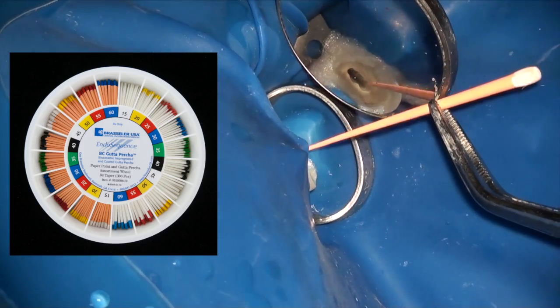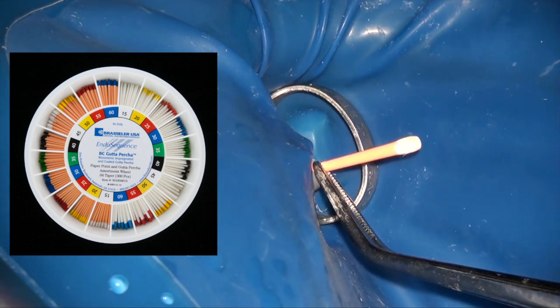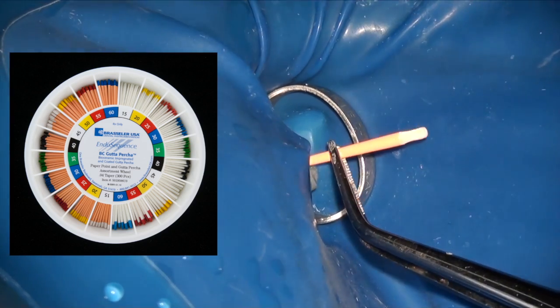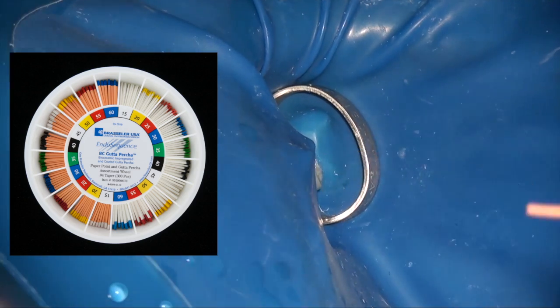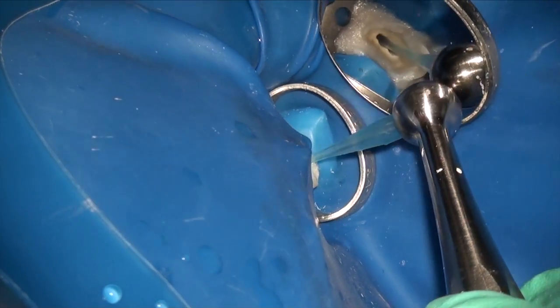Now I'm basically fitting my matching BC cones, bioceramic cones. This is the 4504 matching cone for these canals. And I make sure that I use these locking pliers and I lock them at the reference point, and I confirm with my endo ring to make sure that they've reached the full 19 millimeters in both canals. And then I lock them there.